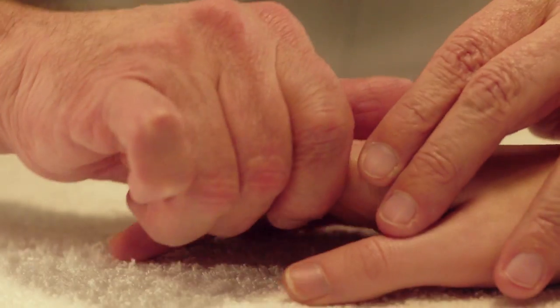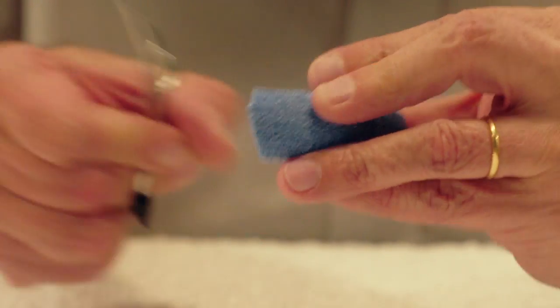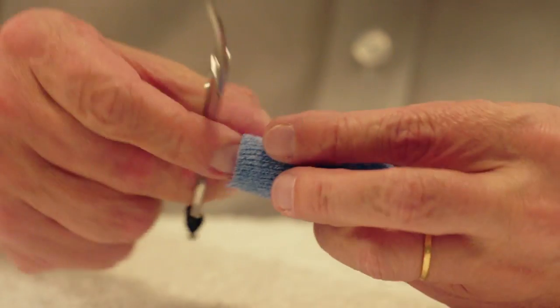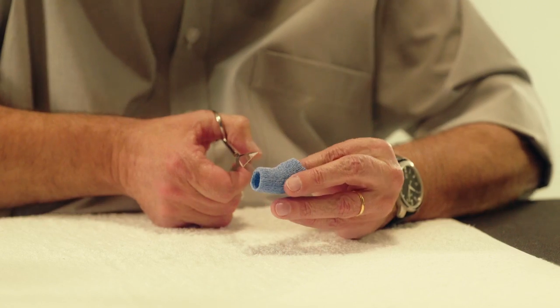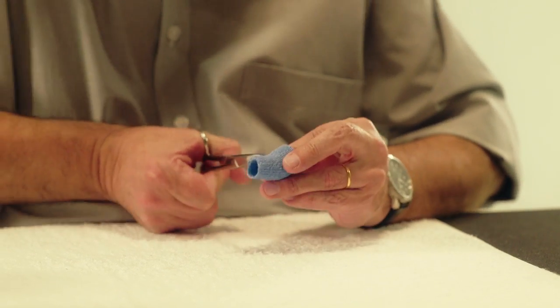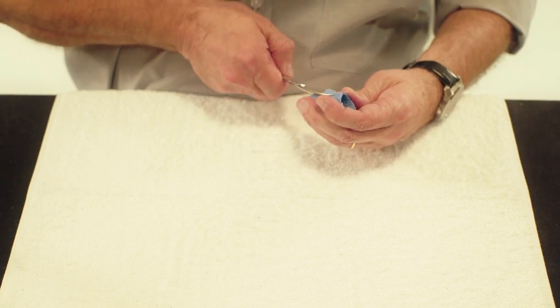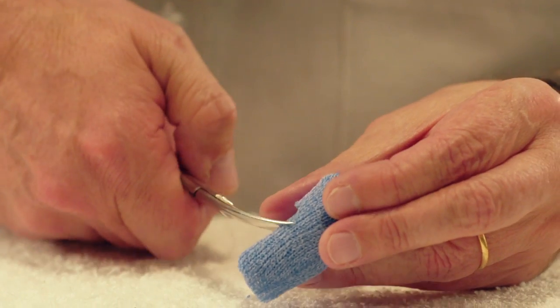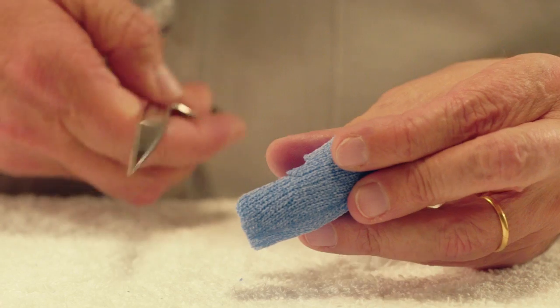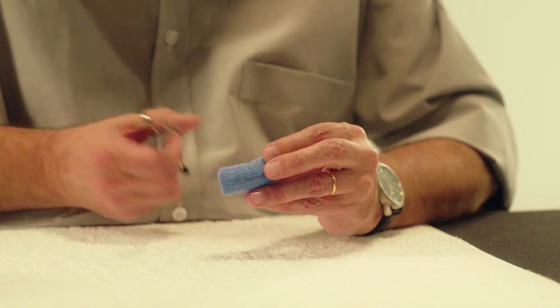Remove the orthosis from the patient and trim the volar distal and proximal portions of the orthosis. Trim an opening on the palmar surface to free the flexion crease of the PIP joint. Cut a small V-shaped piece at both lateral edges of the opening of the PIP flexion crease.